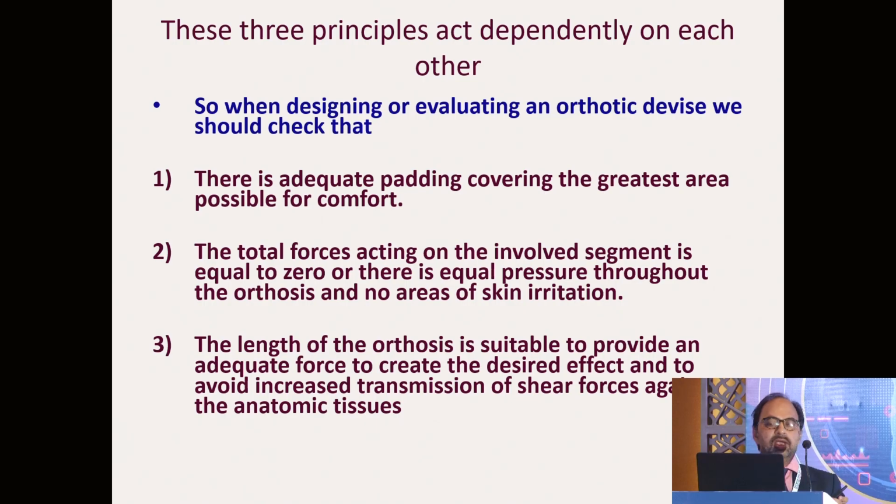So when we design an orthosis or we order an orthosis, when we go for checkout, we should see that there is adequate padding covering the greatest area possible for comfort. The total forces acting on the involved segment is equal to 0 and there is equal pressure throughout the orthosis and no areas of skin irritation, and the length of the orthosis should be suitable to provide adequate force to create the desired effect and to avoid increased transmission of shear forces. So by this we understand all these three factors are interdependent.